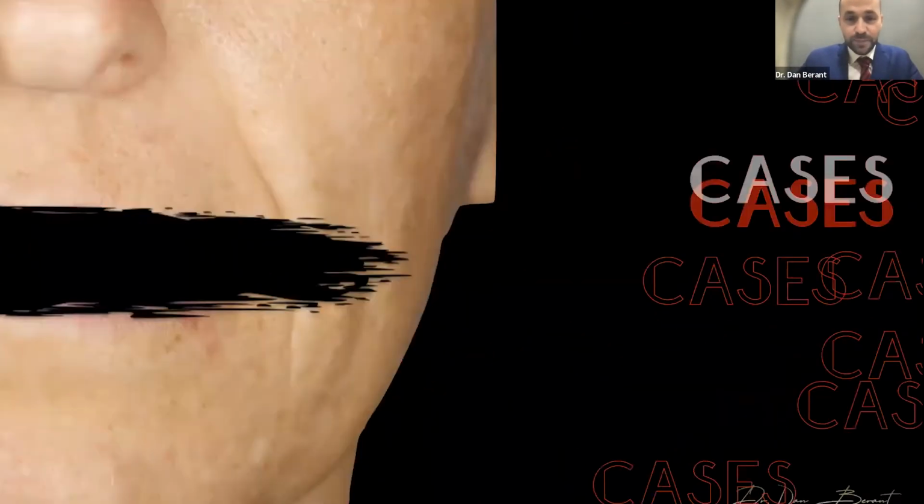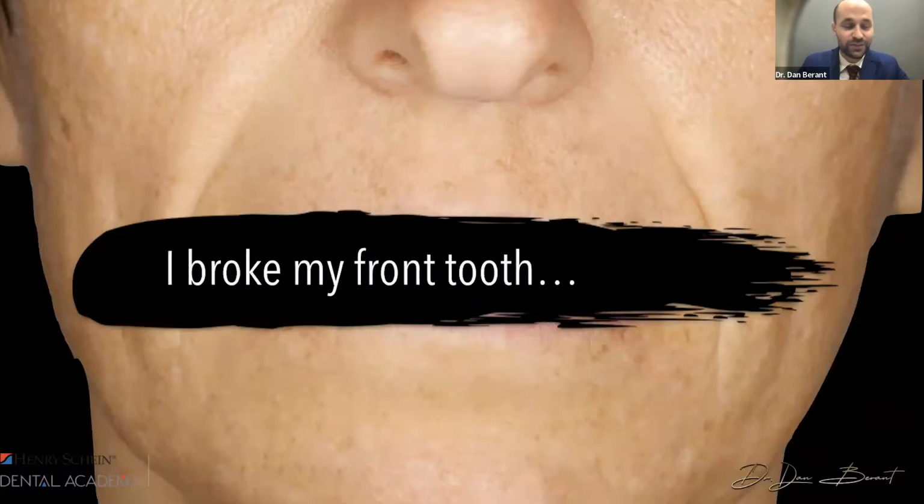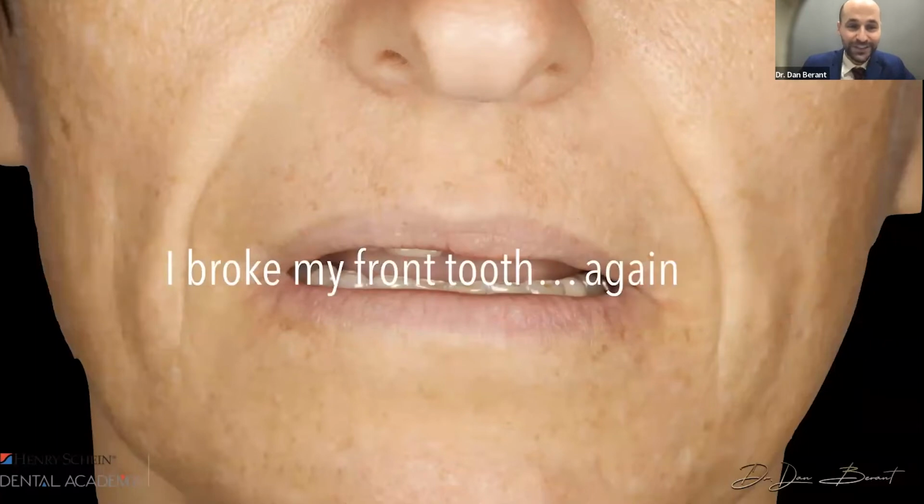And so case one is a patient that came to me with the chief concern, I broke my front tooth. And so this patient broke her tooth 4 times, same crown kept coming off. And so she came to me with zero interest, unfortunately, in trying to save it, even though that is my true love, saving teeth.